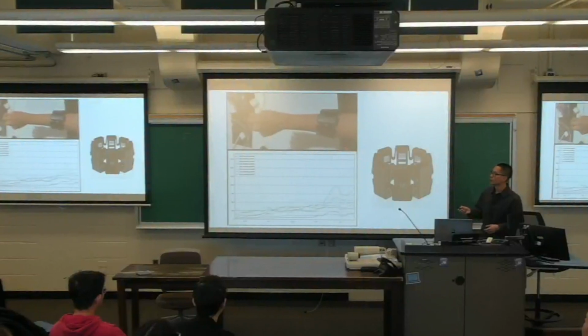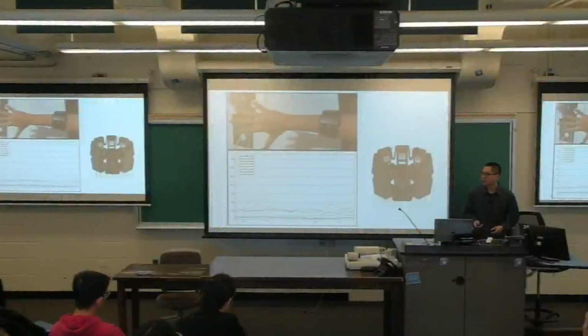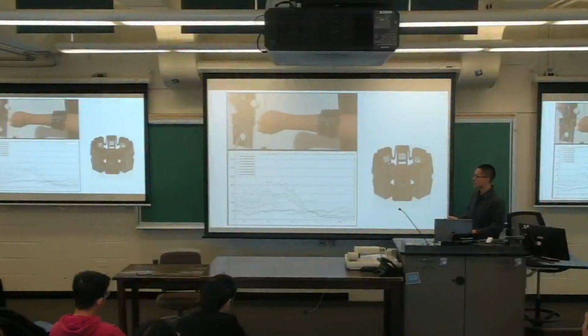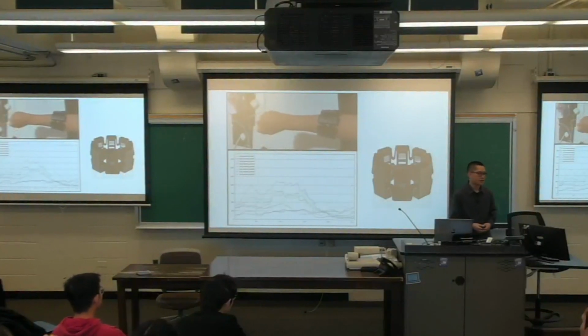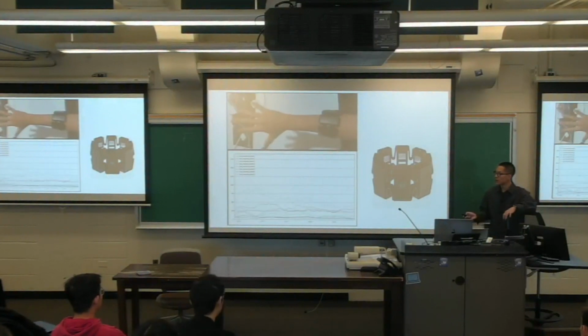But it's worth noting that I'm a healthy subject, but these will be much more subtle, if any, on stroke subjects. So that will be the challenge. Because you can see my signal reaches around 1/1500 sometimes, but on stroke subjects, it's never as intense as this. So this is the feature we're going to use.